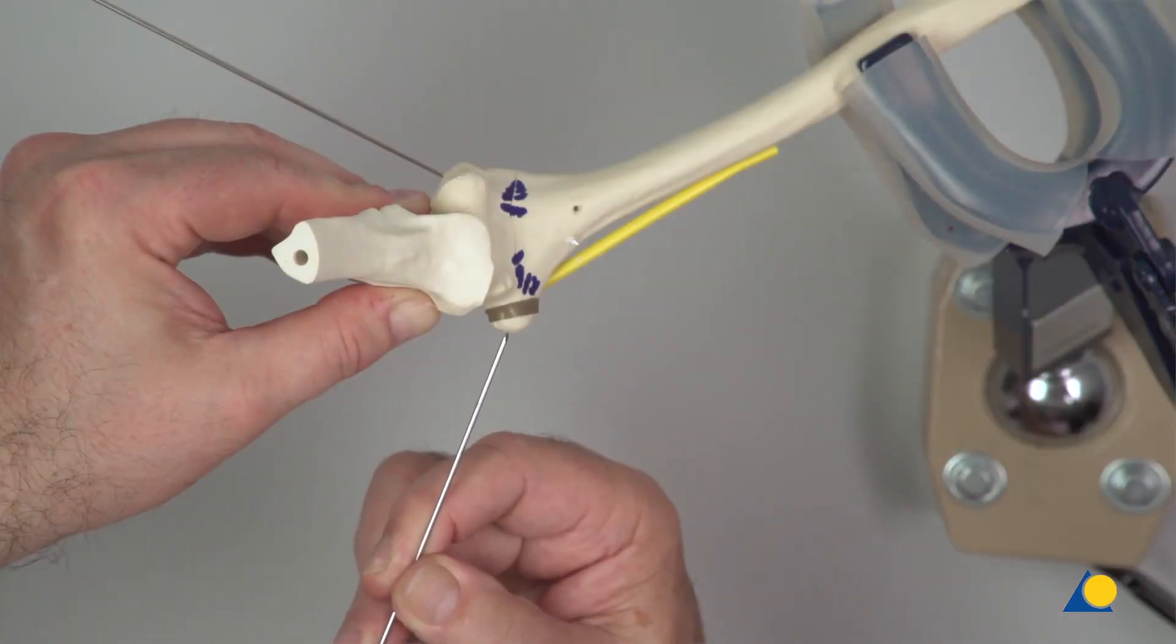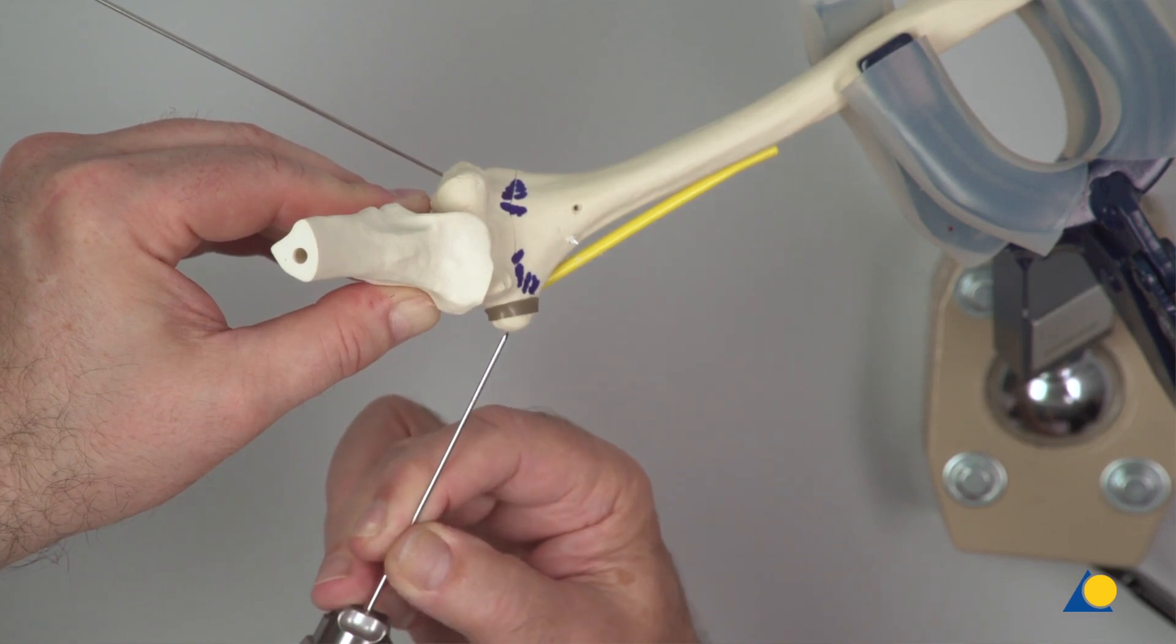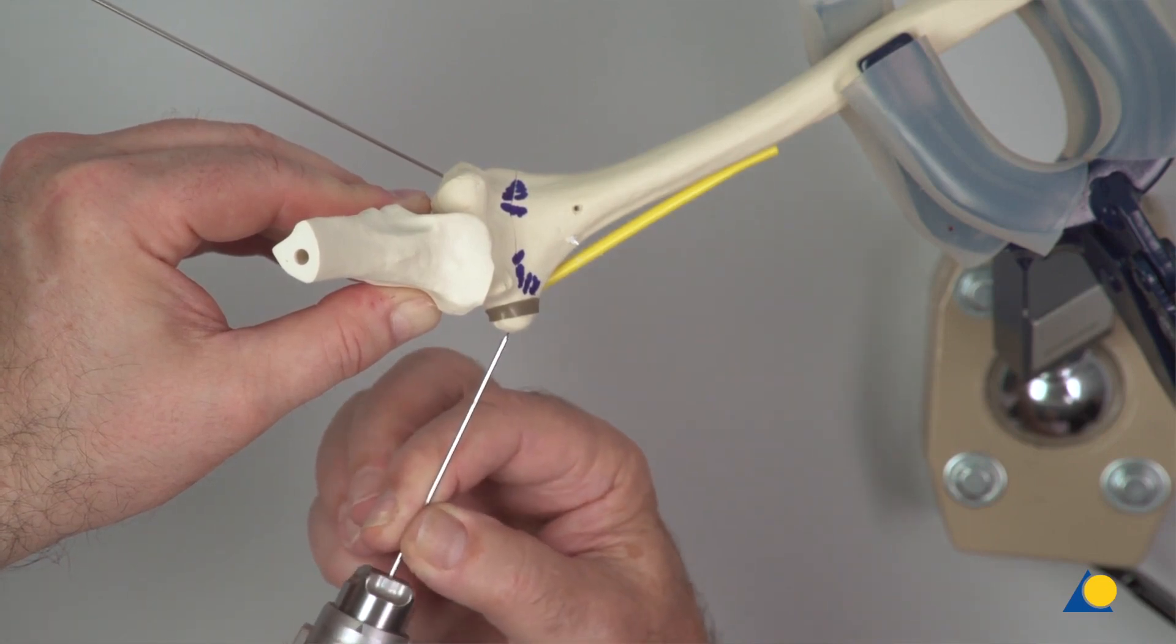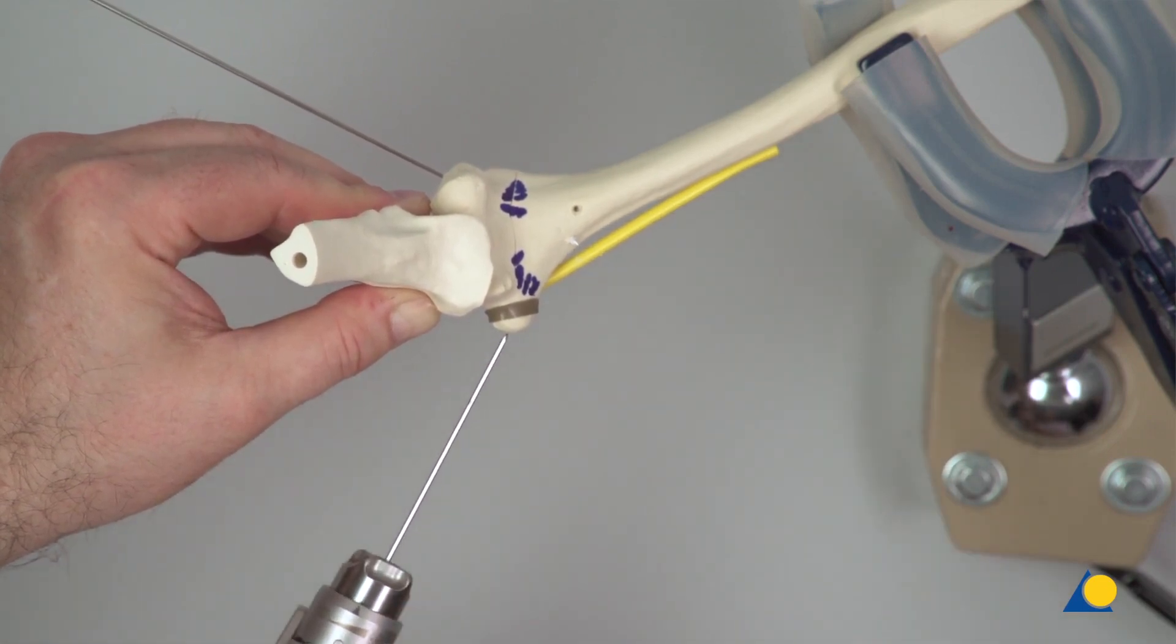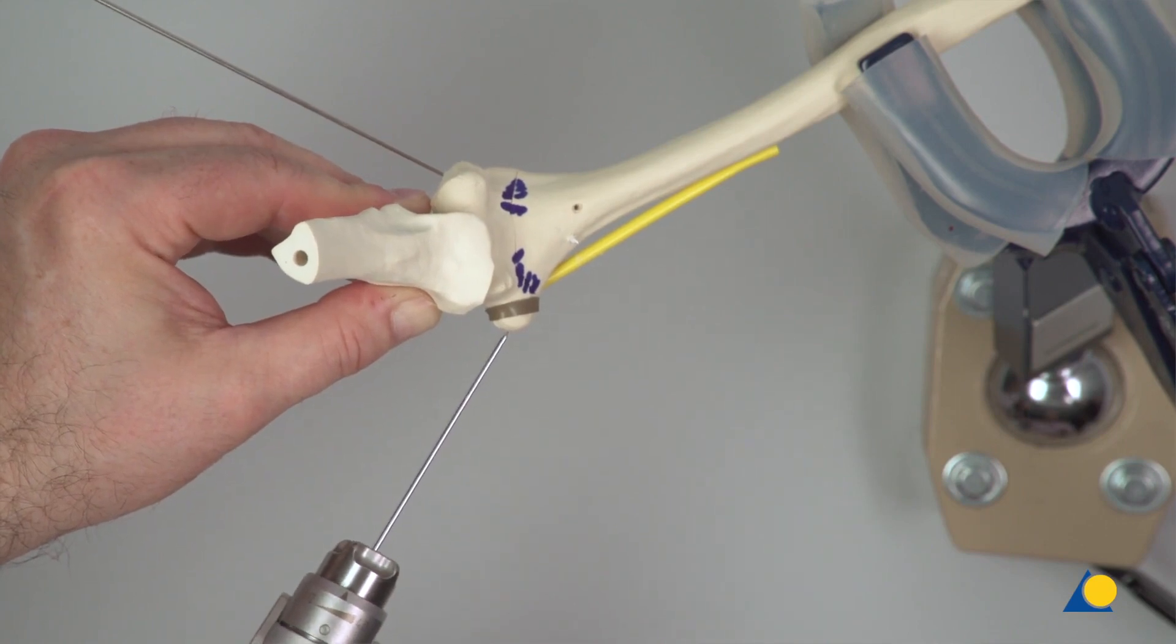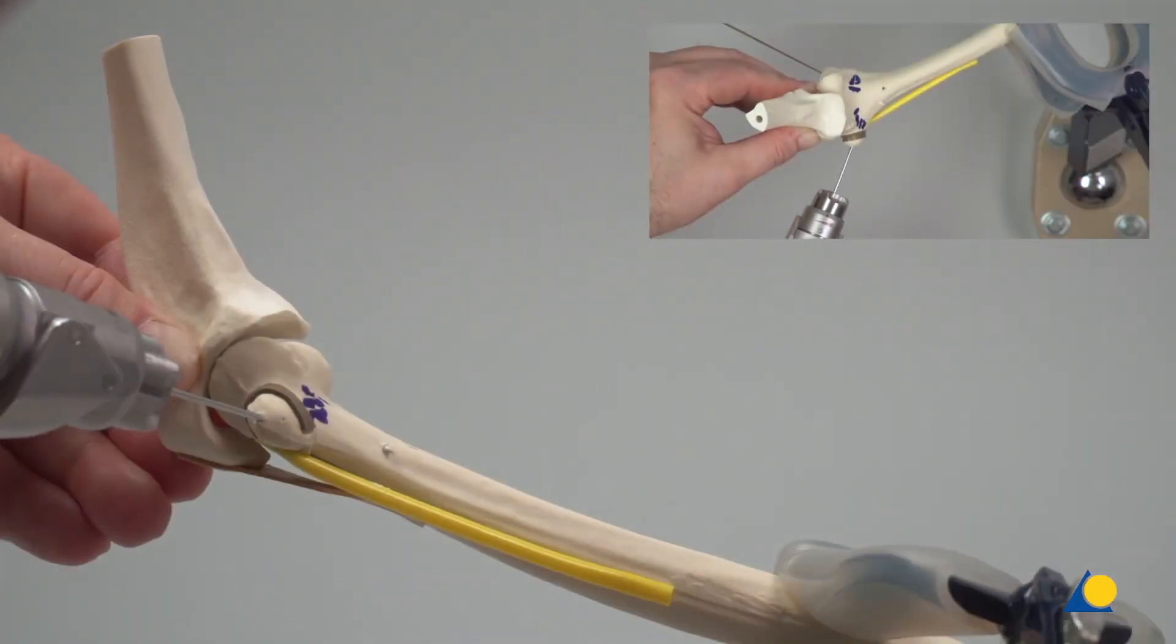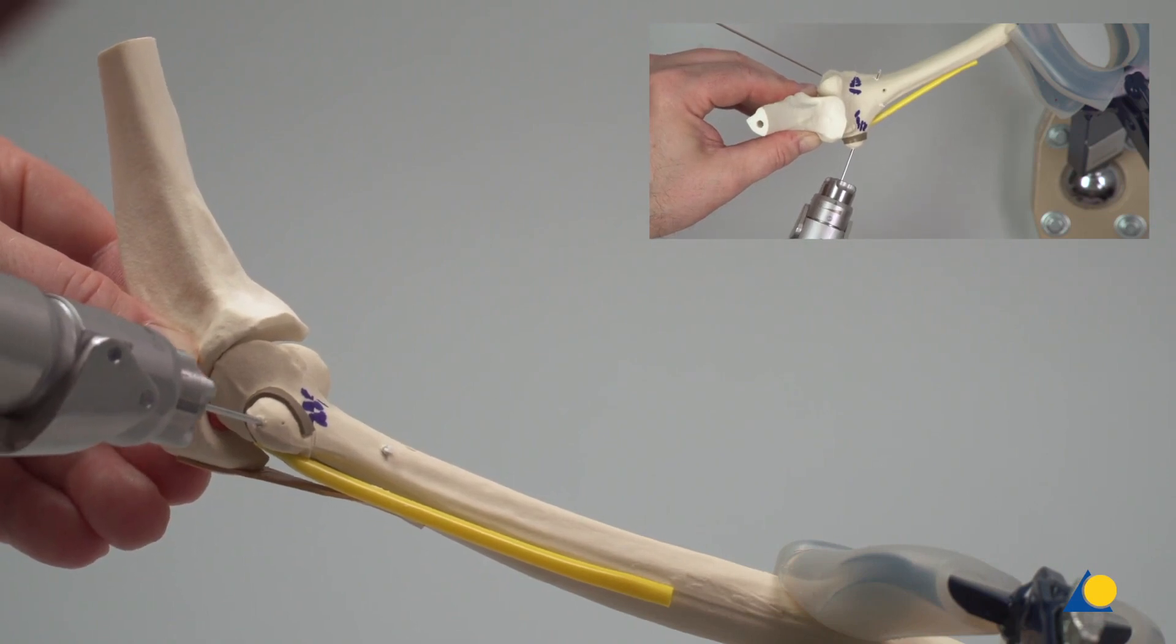Clinically, the elbow would be in a more extended position in order to relax the ulnar nerve and prevent nerve injury. It can be seen as the path of the K-wire is towards the axis, there is no danger of injury to the ulnar nerve.